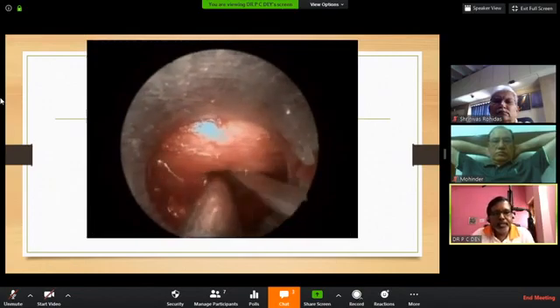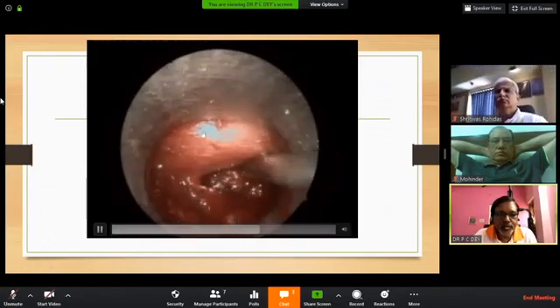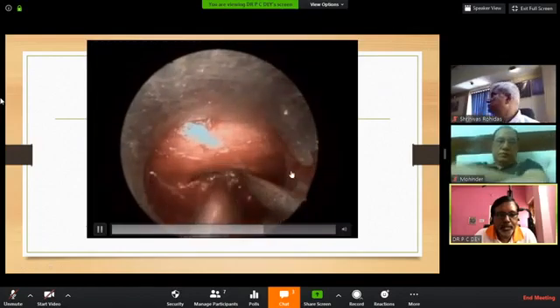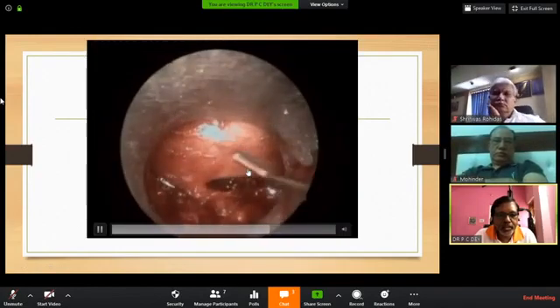On the left side is the cranial. This is your cranial. This is the left approach, caudal and midline lateral. This is your exiting nerve root. I have removed a little bit of extra bone here. The traversing nerve root will be somewhere here, and this is your exiting nerve root. And then I was searching with my hook, where is that culprit.